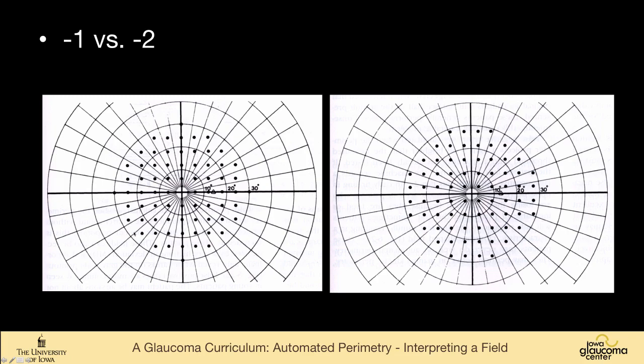So 24-2 means that we're using a dash-2 strategy. So this is the dash-1, and this is the original, on the original Octopus unit, where there are test points along the horizontal, test points along the vertical, and then every 6 degrees going out. The problem with that is that if you had a neurologic defect or a glaucomatous defect, these points may or may not be affected because it's right on the area of interest. And so the dash-2 strategy moves the points 3 degrees above and below, left and right, of the meridia. And so we're not testing right along the horizontal, we're testing right above it or right below it.